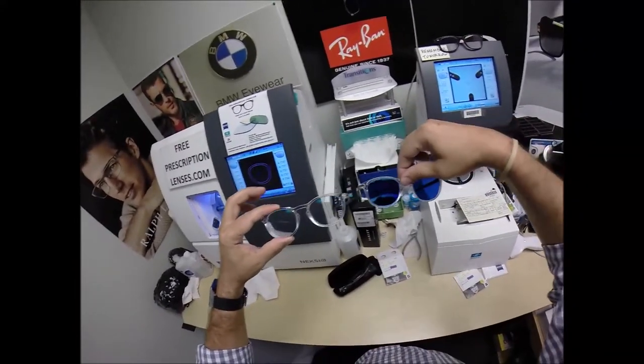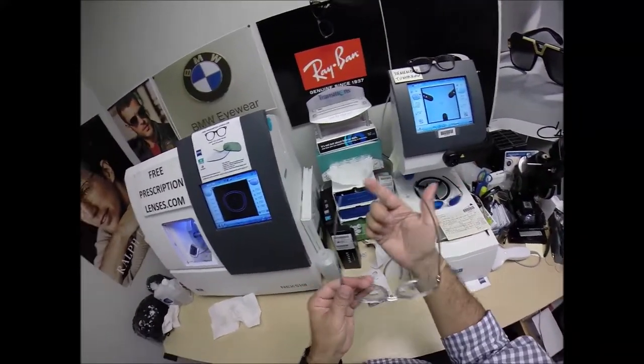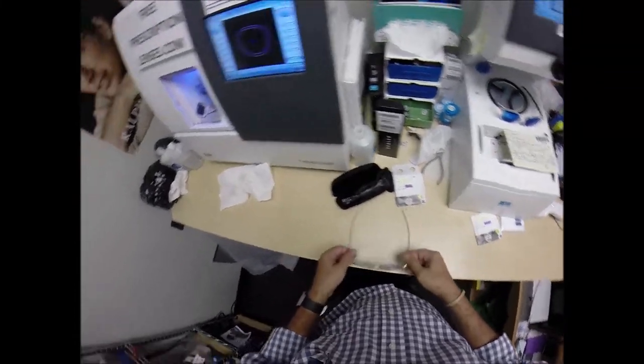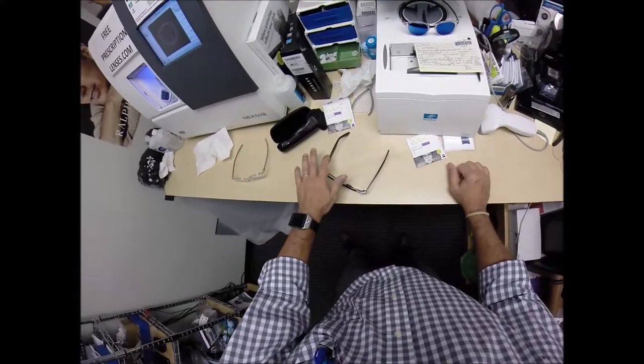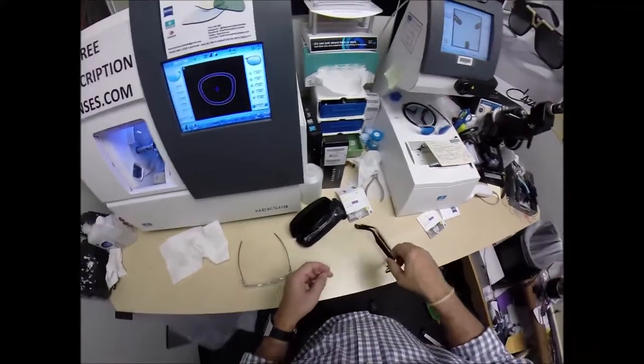but I'm going to get them in standard alignment first, also known as the three-point stance. The 3 points are 1, 2, and the bottom of the frame being 3. I set them on the counter and press down. There is no wobble. Now, when I say wobble, I'm part of that 80%. When I take mine off and press down, they wobble on the counter, but they sit level on me.